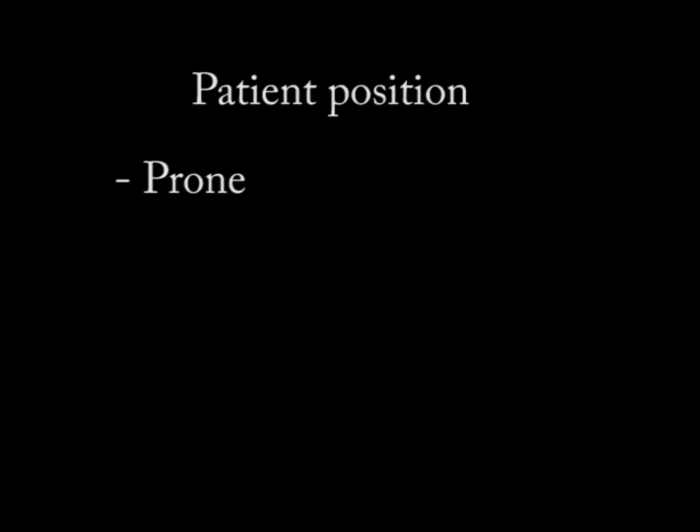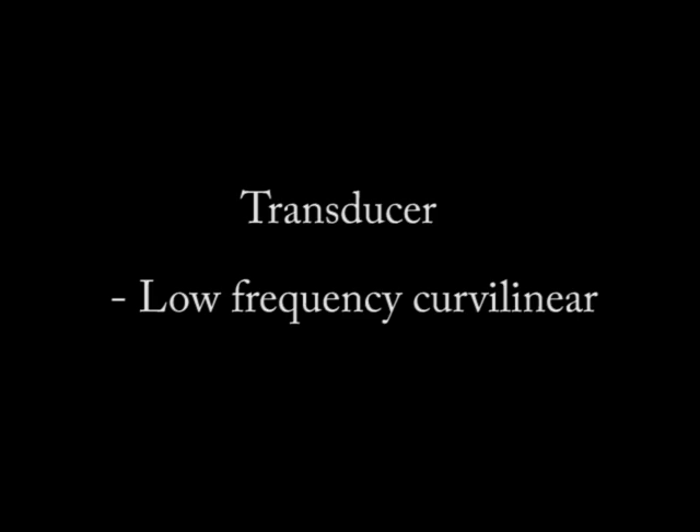The ideal patient position is prone — we have them on their stomach and try to make them as comfortable as possible. Because the SI joint is often deep, we need to use a low-frequency curvilinear probe. If the person has a thinner body habitus, I will try to use the high-frequency probe.